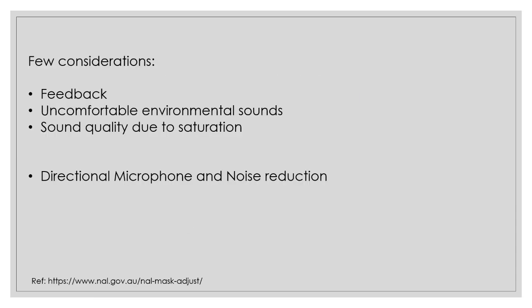They also recommend to switch on the directional microphone and the noise reduction to the fullest available, because when we focus on an individual who is speaking to us wearing a mask, we don't want the sounds that are surrounding us to be disturbing us.